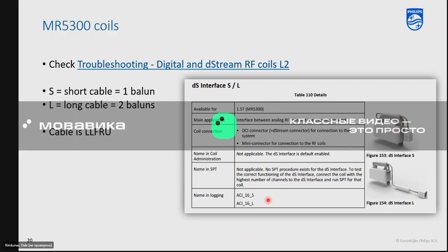So if you ever see this and you only have one on site, but you see that there's two available as FRUs, that's what those differences are. Here's a link directly to fixing and repairing coils that are used on that system there.